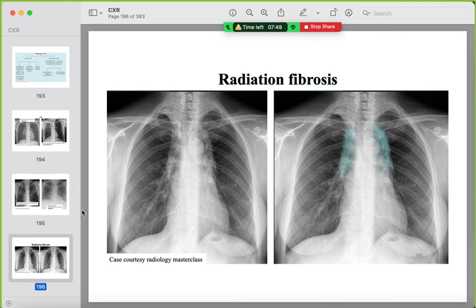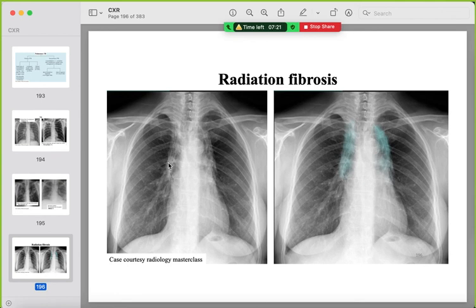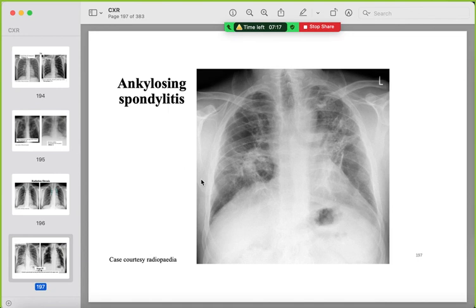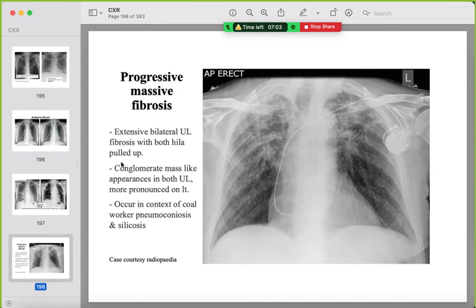Mimicker for upper lobe fibrosis: radiation fibrosis after radiotherapy for mediastinal or thyroid mass — the changes are sharp, clear, and confined to a defined area. Ankylosing spondylitis causes bilateral upper lobe fibrosis. Progressive massive fibrosis (in coal worker's pneumoconiosis or silicosis) shows confluent changes and conglomerate masses with architectural distortion and volume loss in both upper lobes.